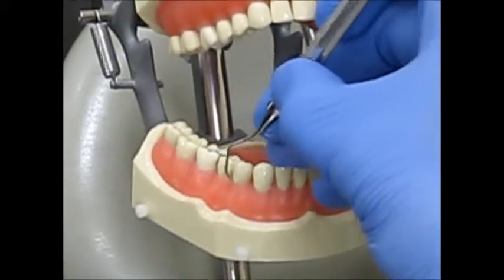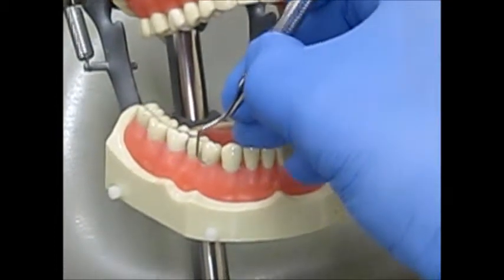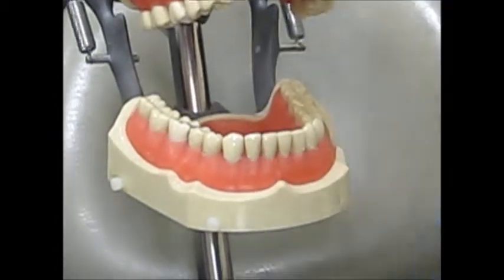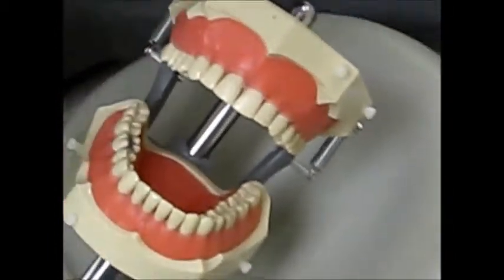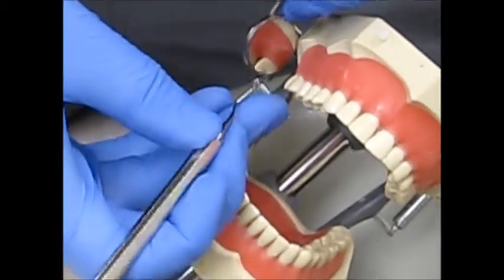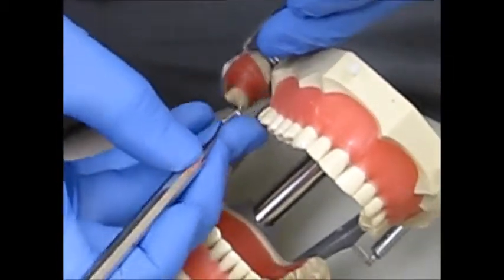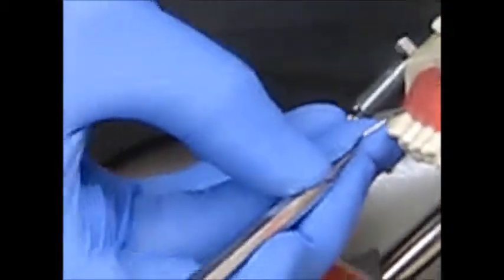In general, you're trying to keep your fulcrum placement one to two teeth away from where you're working. For maxillary toward surfaces, you're going to be seated between 9 and 10 o'clock, with your palm up towards the maxilla.